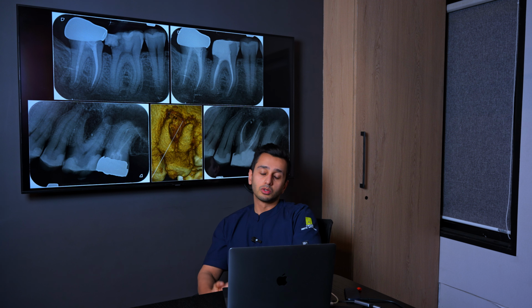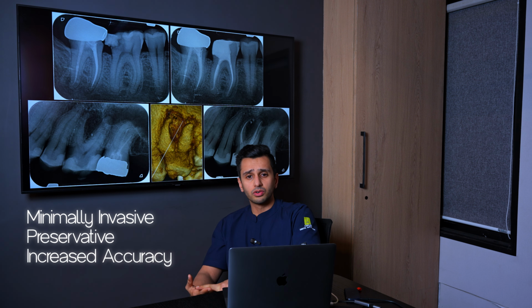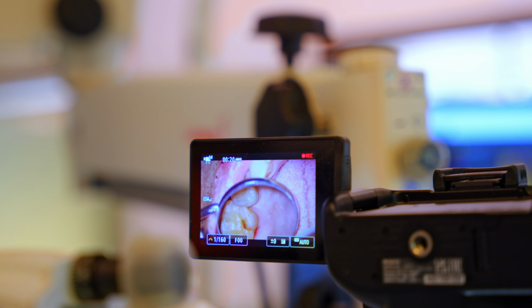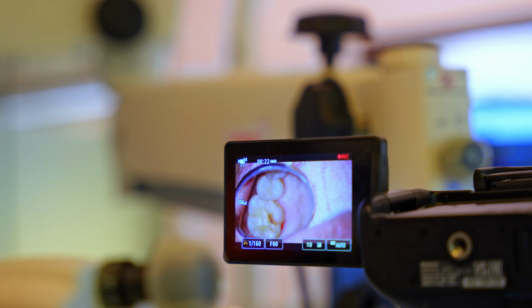It also helps in tooth preservation, increases the accuracy of your treatments, and helps you be minimally invasive at the end of it. The more preservative you are, the higher the chance of success and survival of the teeth or treatments that we do in daily practice. And we also have a camera attached to the microscope, through which we do a lot of documenting, not only from an educational standpoint but also for patient education.